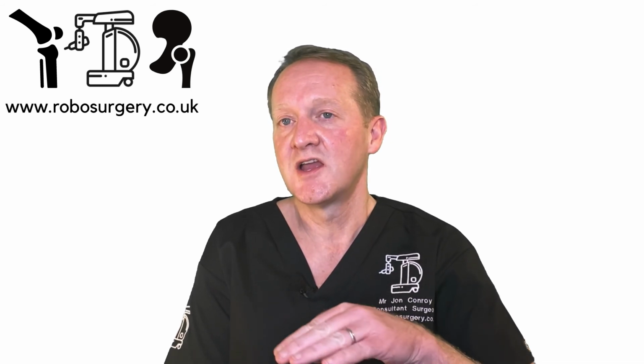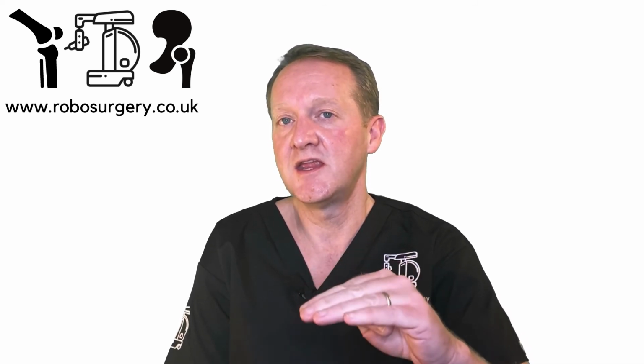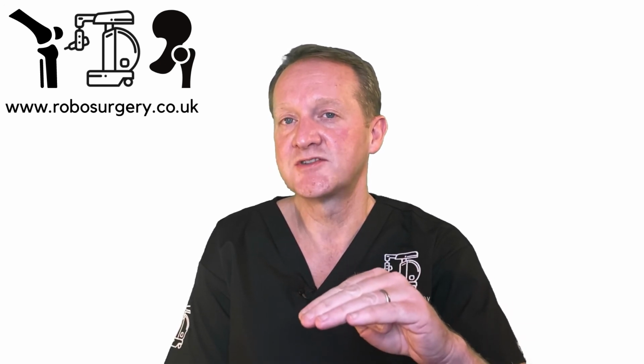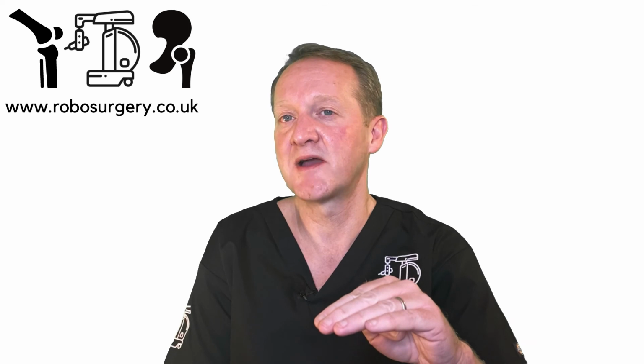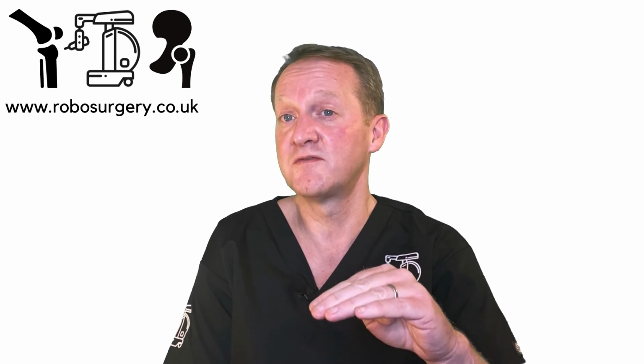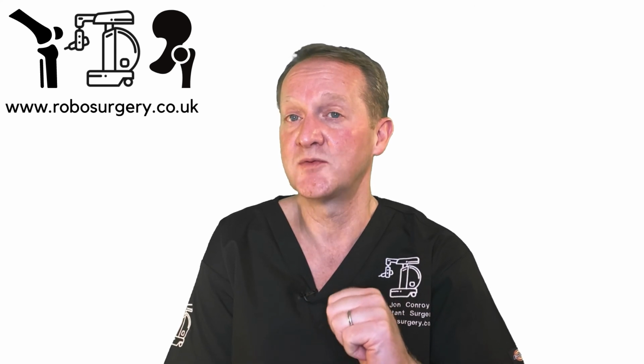as the blade cuts through the bone, as soon as it enters the other side of the bone, the blade cuts out to reduce any damage to the soft tissues in the area of the bone cut. Now, this can make a huge difference to patients. If the blade impinges on some of the soft tissues in the knee, that can cause bleeding and also the nerve fibres in the soft tissues can give the patients pain. So we believe that the accurate cuts and the limitation of the cuts to only bone without harming soft tissues can be another factor for the improvement in pain that we see in these patients.